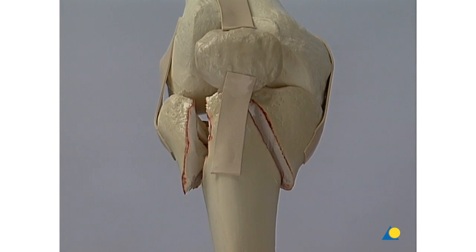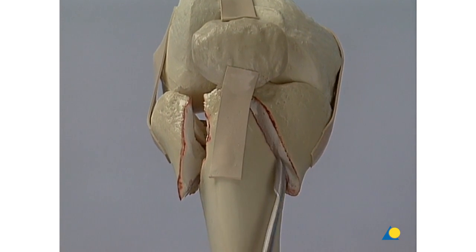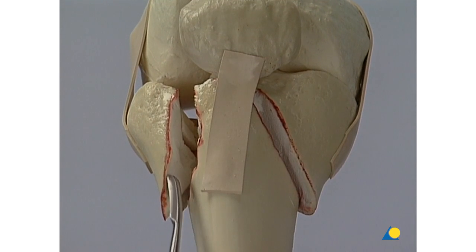The model shows a large bone block medially and considerable comminution laterally.